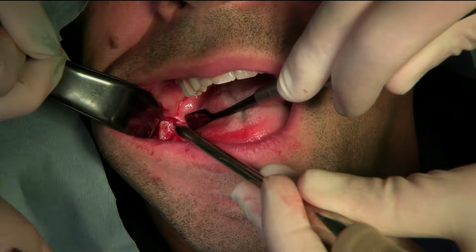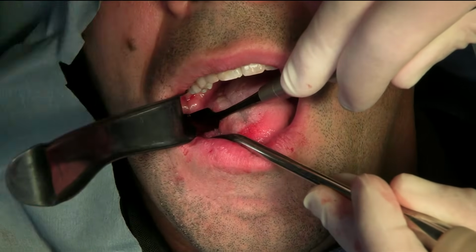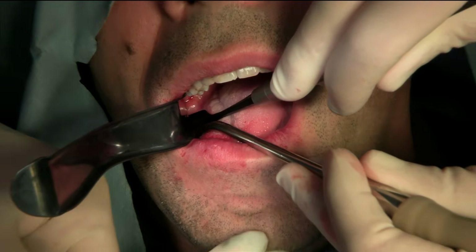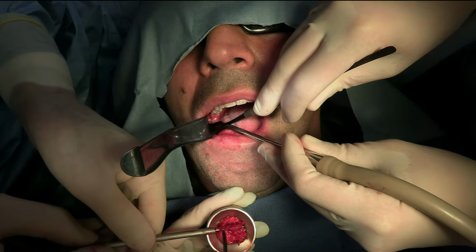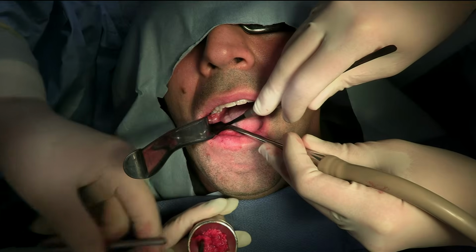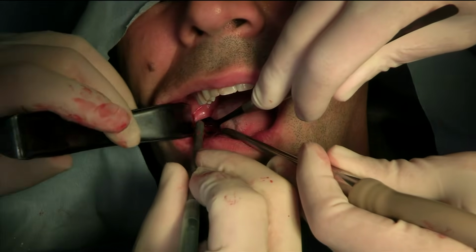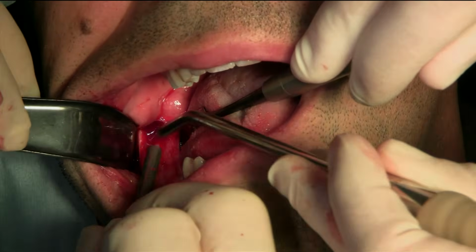Okay. Let's see how much we have. Dap and dish. Sorry. That was a good pass. I think I got the angle now. So we'll do one more, and that should be in it. Okay, let's do the same thing like we just did. Okay, hold it here.